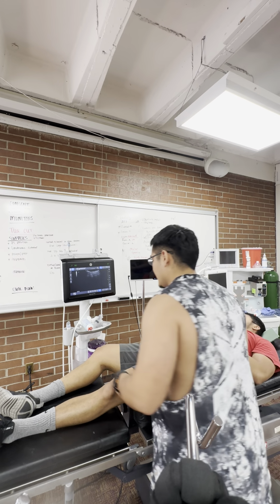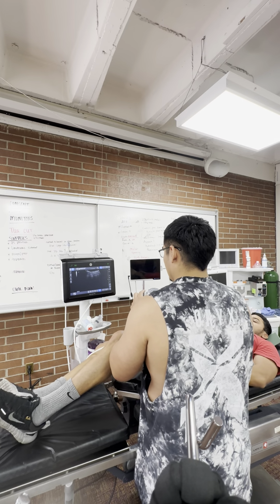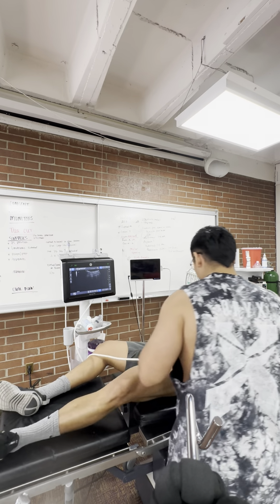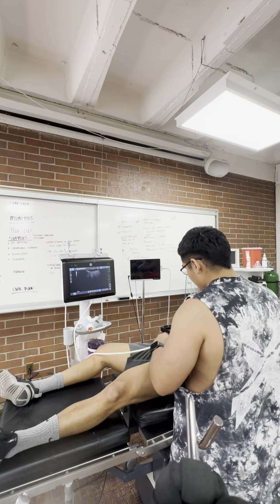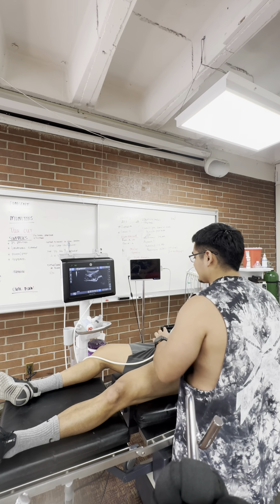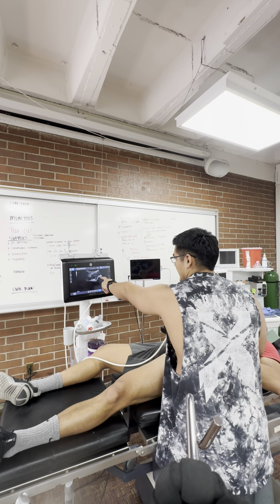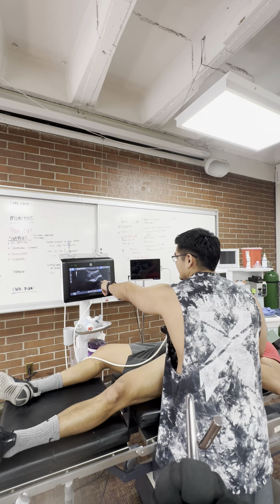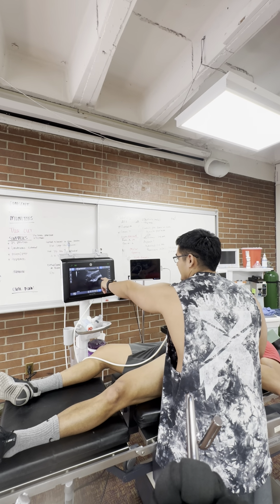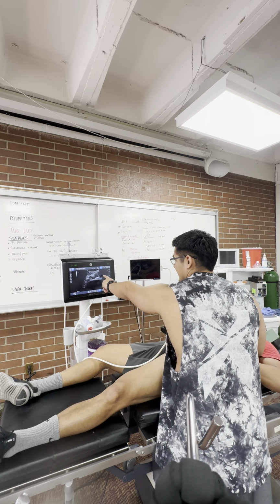So after that, we're going to go ahead and grab our probe, and then we're going to go ahead and place it over the patient's iliac crest here. So we have the AIIS, anterior inferior iliac spine, and then we also have the curvature of the bone here.